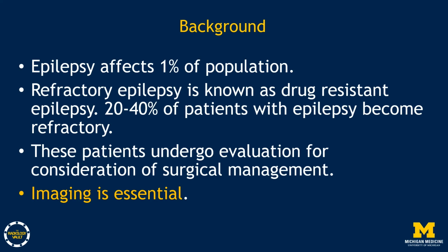Background: epilepsy affects 1% of the population. Refractory epilepsy, also known as drug-resistant epilepsy, occurs in 20 to 40% of patients with epilepsy. These patients are considered for surgical evaluation, and to do so, imaging is essential in this workup.